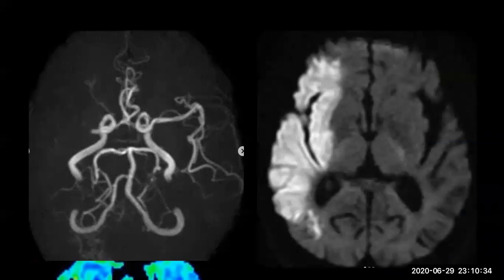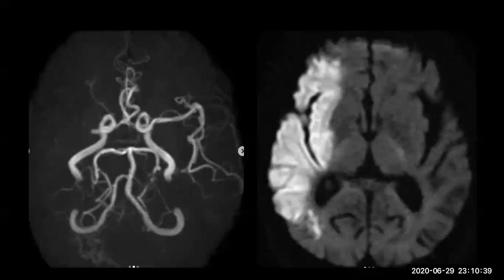Okay. This is a right middle cerebral artery infarction. Step by step. Now this is a spot. What is this? MRV? MRA. Why V? MRA and diffusion weighted. MRA, what do you see? Diffusion.